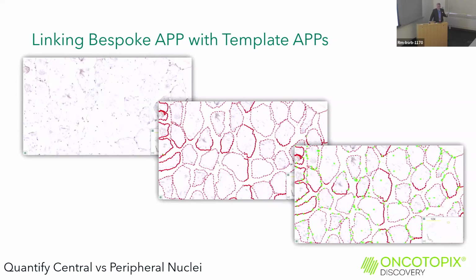So it's a very exciting platform to work with because you're interacting with these images on a regular basis. And I know I've shown you a lot of things in chromogenic space, in bright field space. We're going to switch into fluorescence, which you're probably more comfortable with in a single cell world. But everything I've shown you here works identically as it would in the fluorescence space.